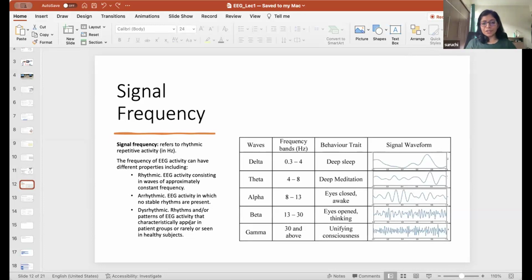So I want to start with frequency. I already explained it to you, right? What is it? It is the sampling rate. Yeah, but generally frequency is a very common thing, like time is a common thing, right? When we say time, we mean something. So when we say frequency, it means the number of repetitions per second. Let's say someone is jumping. You can have a frequency of jumping of 2 times per second, or half a time per second, which means 1 time in every 2 seconds.